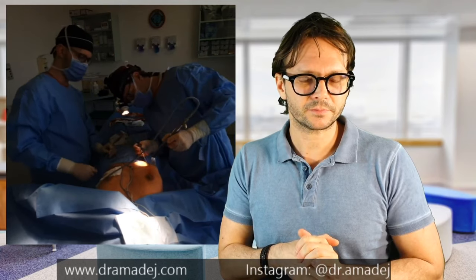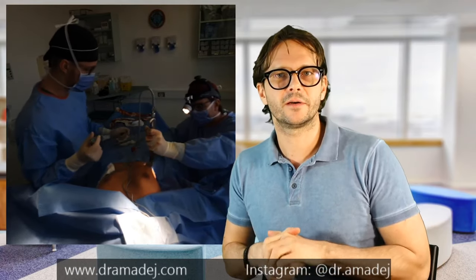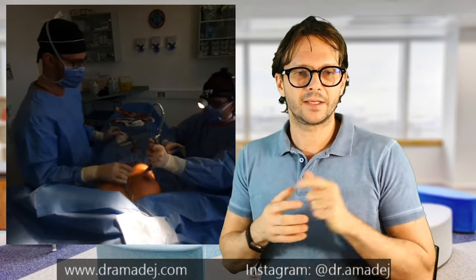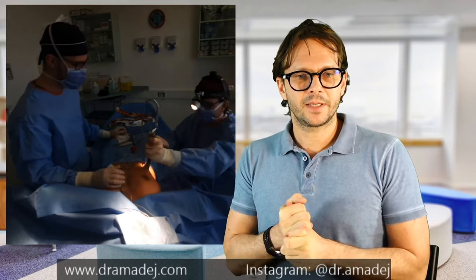Finishing the right side — there is a little bit of blood but nothing much. In this particular case we are using a Mentor implant — moderate plus profile, round implant of 275 milliliters. This is a very active girl who does a lot of sports and fitness and preferred not to go too big. The choice was perfect for her body — it did augment the breast and make it bigger, but it's not too much and she can do sports and all activities without any problems. She is about two months after surgery now.